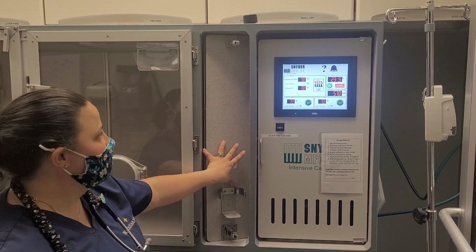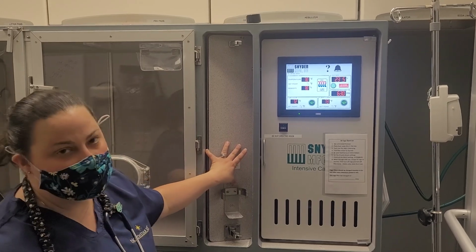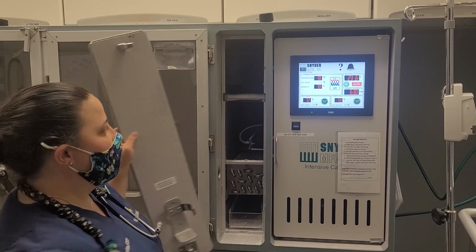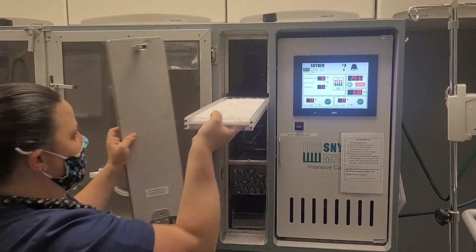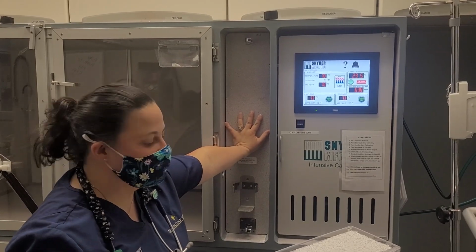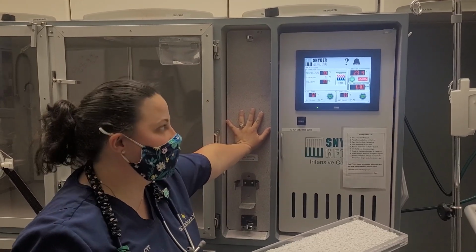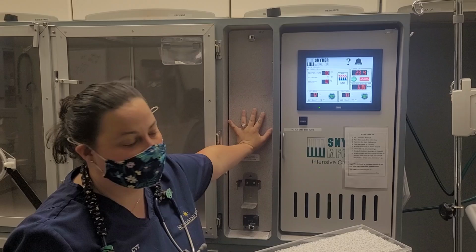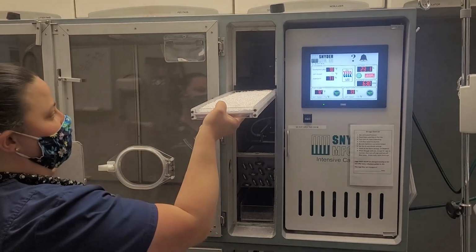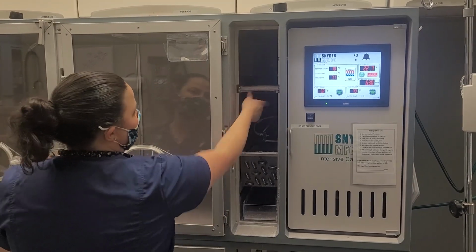Obviously, you're going to leak here with your changing of your soda lime. So you want to make sure that when you take your tray out, you close this door again while you change out your soda sorb, so your patient still has some oxygen and you're not taking everything away. So we're going to make sure that this door is latched to keep our oxygen percentage high.